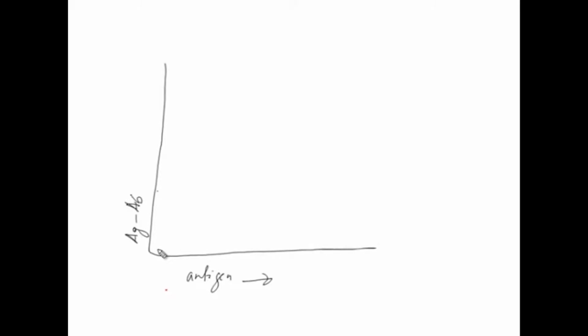If I show you, the precipitin curve will look something like this. You have antigen on this axis and you have the antigen-antibody precipitate, Ag for antigen, Ab for antibody, or you can say the precipitate which is seen as you add the antigen. So, what you see is a curve that looks like this kind of pattern, where you have certain regions.